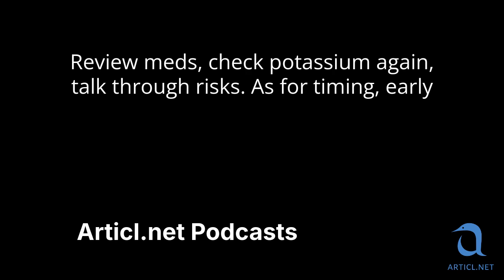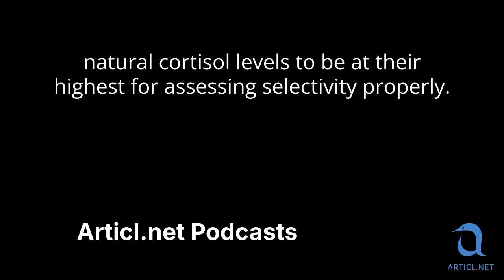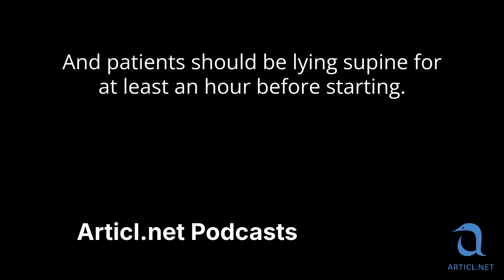As for timing, early morning is best. It helps level out the diurnal hormone fluctuations. You want natural cortisol levels to be at their highest for assessing selectivity properly. And patients should be lying supine for at least an hour before starting.